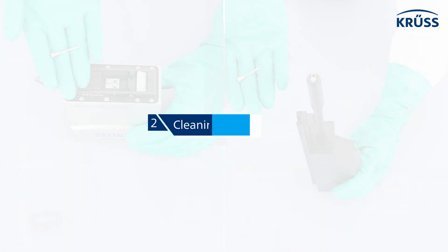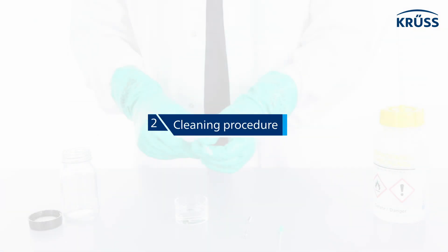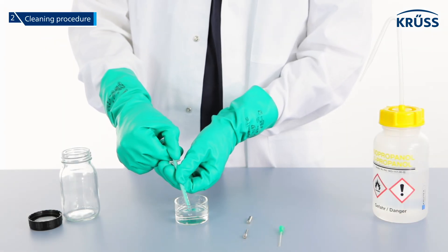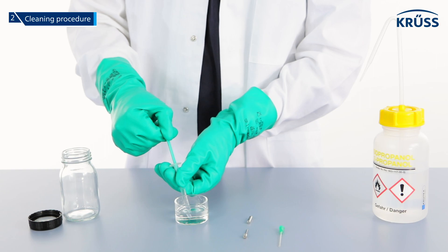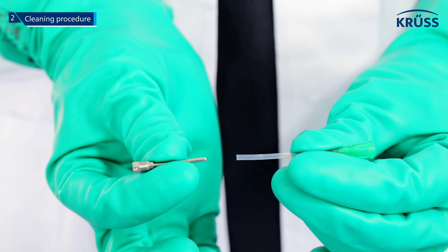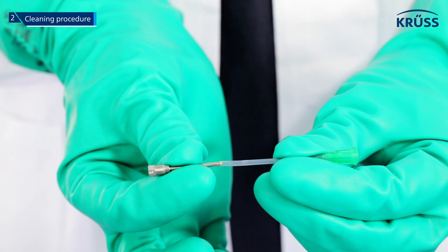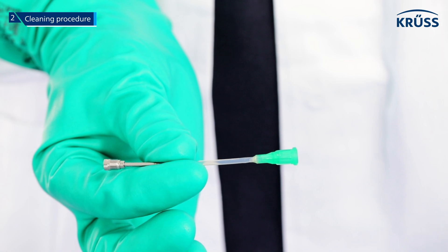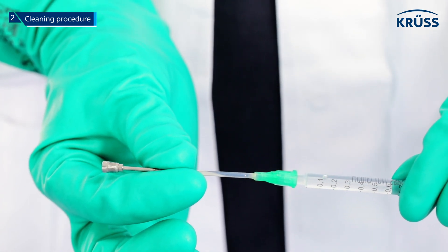Step two: cleaning procedure. Fill the supplied syringe fully with isopropanol. Push the thin side of the valve hand tight into the plastic needle, and push the other end of the plastic needle onto the filled syringe.